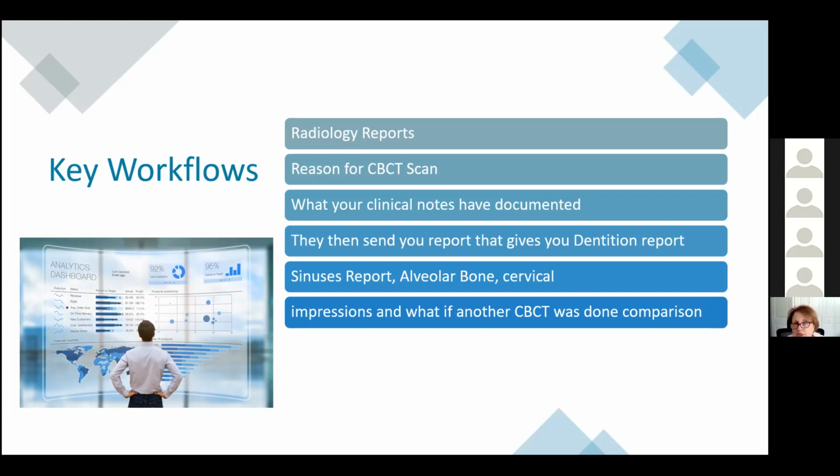So it's what your clinical notes have documented. And so we're going to learn, how do you look at the notes that are documented before your patient comes in and after you do your clinical exam. That's very important on how you refer the patient for that CBCT scan. And then you send your report that gives your dentition report.